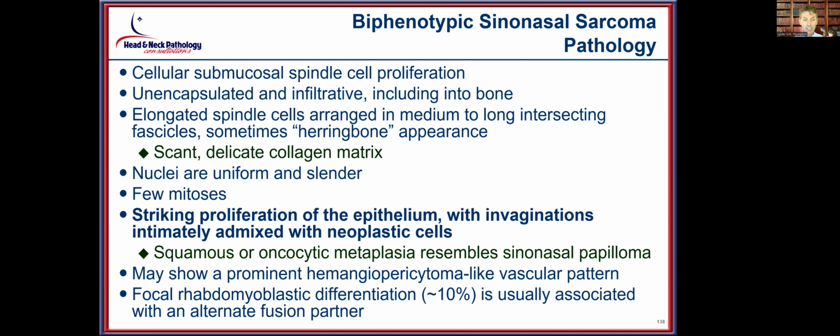However, there is this very striking proliferation of the epithelium that extends down as invaginations that is intimately associated with the neoplastic cells, and it can undergo squamous metaplasia or even oncocytic metaplasia. So sometimes it will even resemble a sinonasal papilloma.